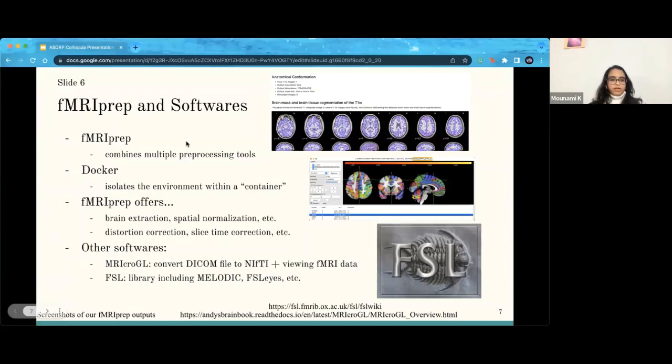All right, so in our attempts to pre-process, the main tool we used was fMRIPrep. fMRIPrep is an fMRI data pre-processing pipeline developed by the NeuroImaging PREProcessing tools, or NiPreps, and uses a combination of multiple pre-processing tools such as FreeSurfer, AFNI, FSL, and ANTs to perform structural and functional pre-processing on raw fMRI data. This pre-processing step allows us to remove noise and fix issues due to motion, such as head movement.